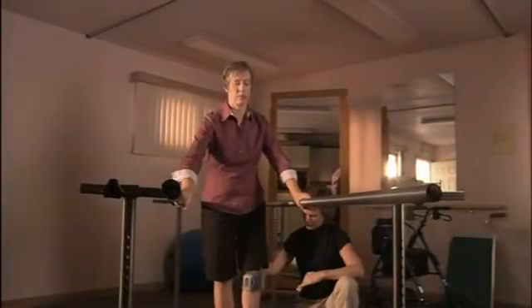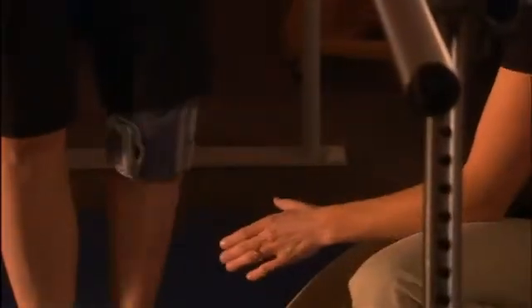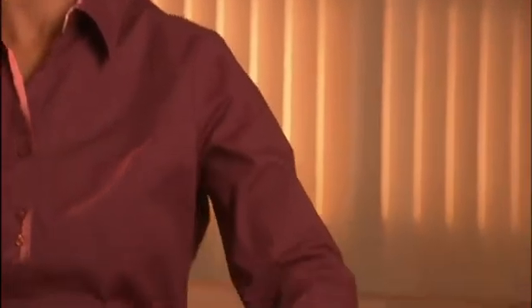The L300 begins to stretch the limits of what we used to be able to tell people they could anticipate in their recovery. The L300 stimulates the muscles and nerves of the lower leg, producing a more natural lift of the toe during ambulation. Their foot lifts and they can place it in a more natural way. This allows them to walk at a more normal pace, with a more normal gait, and to not be in as much danger of tripping or losing their balance.